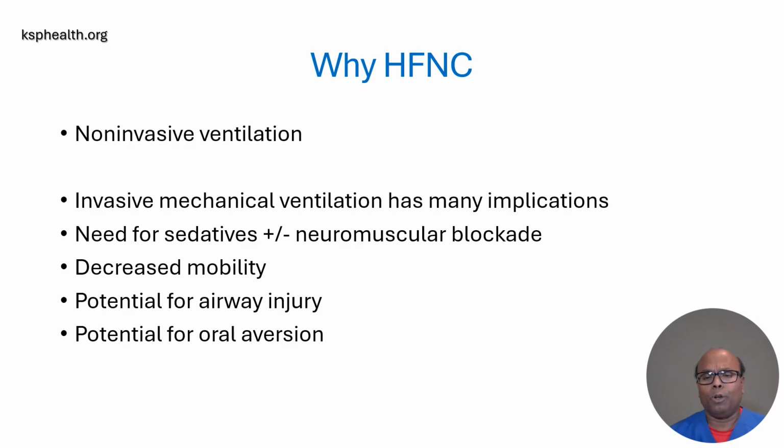Why do we need to do a high flow nasal cannula? Because invasive mechanical ventilation has many issues, like the need for sedatives, usage of neuromuscular blocking agents, decreased mobility of the patient, potential for airway injury, and potential for oral aversion, especially when you are dealing with influenza and RSV. When you intubate, they usually stay intubated at least for a week, provided they do not develop any kind of complications.